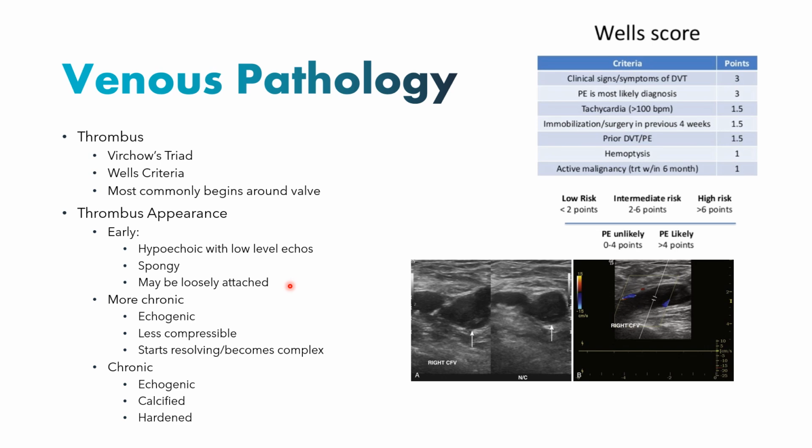The scary thing about these is they are the most loosely attached. So these are the ones that you're most likely to throw a clot with. I know as technologists, once we find these, if it looks loosely attached, we know they have a thrombus. Lots of times we'll discontinue our augmenting practices to be careful not to dislodge a thrombus and send out an embolism.